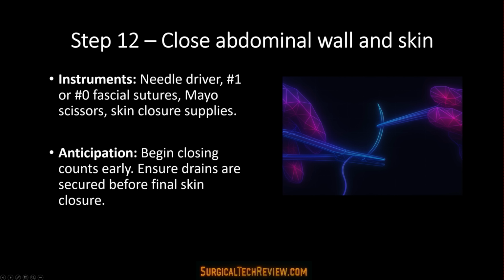Step 12. Close abdominal wall and skin. Closure proceeds in layers, and counts should be confirmed early to ensure patient safety. Instruments are needle driver, fascial sutures, Mayo scissors, skin closure supplies. Anticipation: begin closing counts early. Ensure drains are secured before final skin closure.